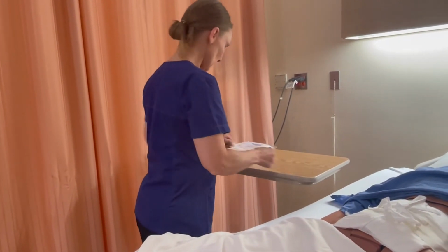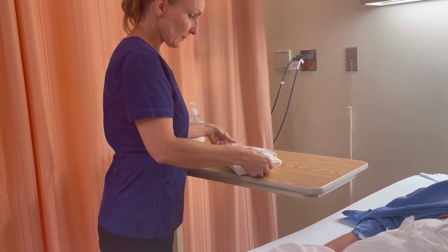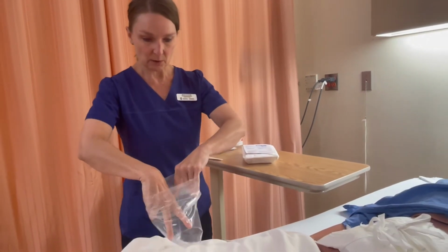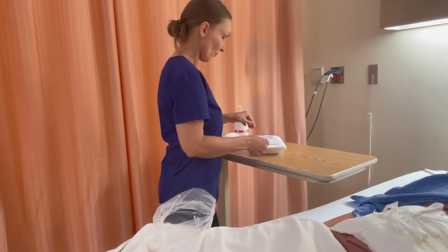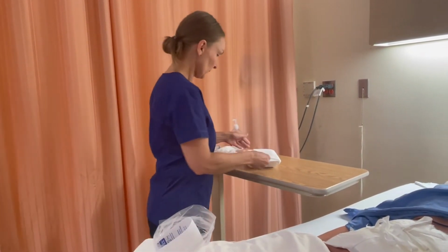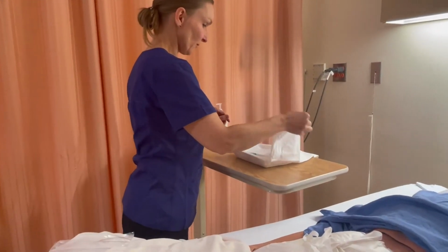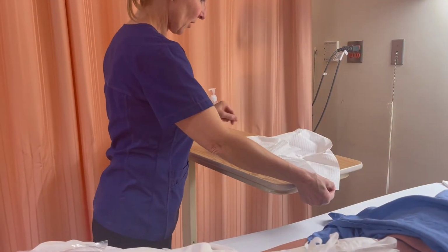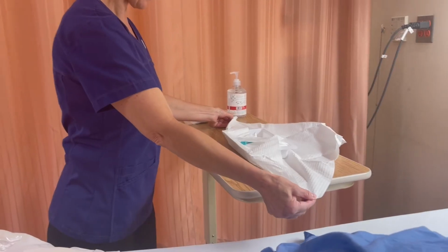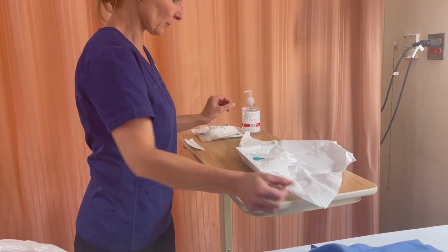I've got my measuring tape here. Sometimes there's no garbage bag in the kit, so I'll just set out a garbage bag here and hopefully we'll have another one inside. Begin by opening my wound care tray and create my sterile field. Often what you need to do is let this fabric, this paper, kind of stretch out because it always wants to flip back on you.